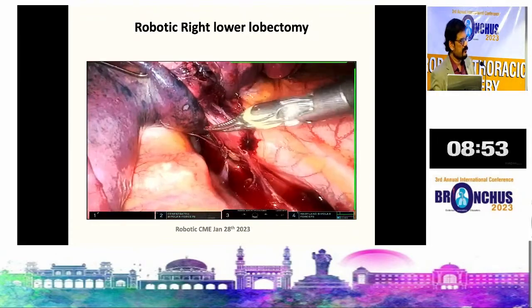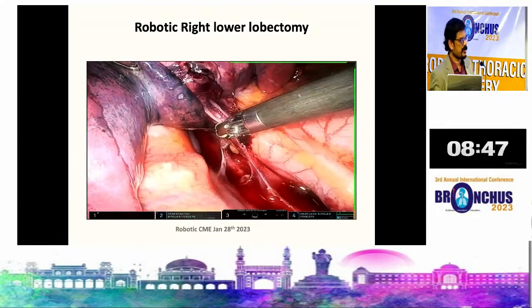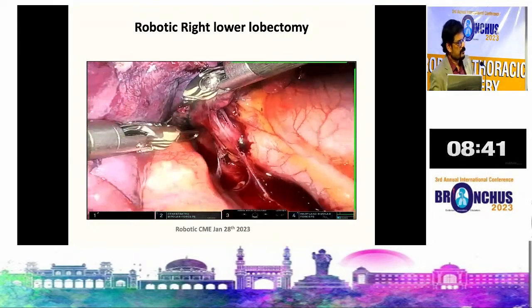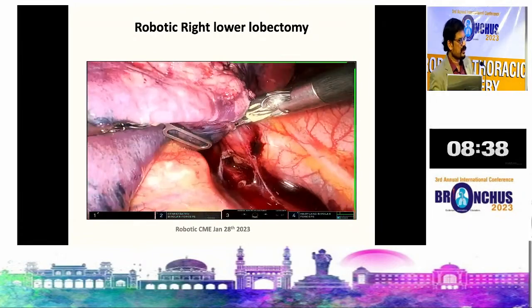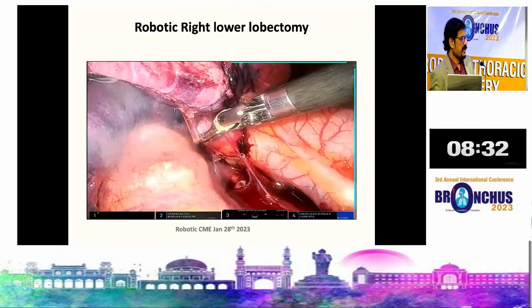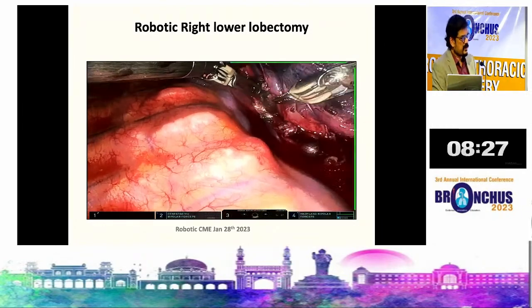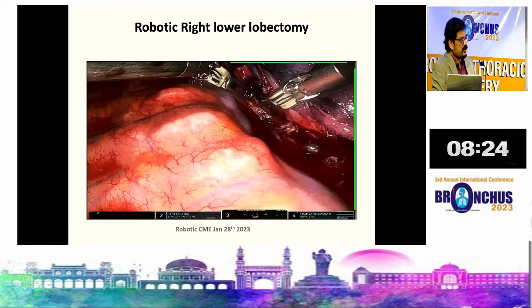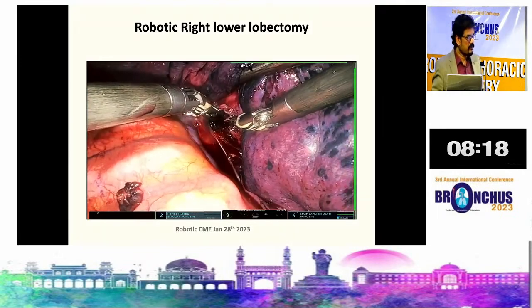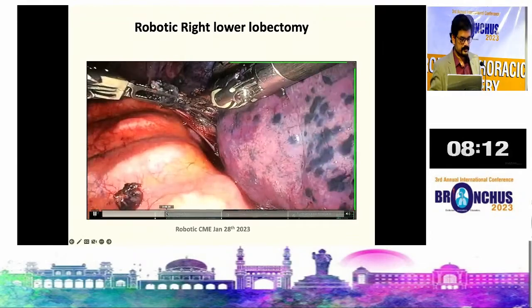We use a normal glove finger to extract lymph nodes, and we go on to dissect around the inferior pulmonary vein there. And we are practically making space for our looping of the vein. So you can see some carinal nodes in a way, and we go on to remove those lymph nodes too. And all the lymph nodes are preferably removed in a pack.